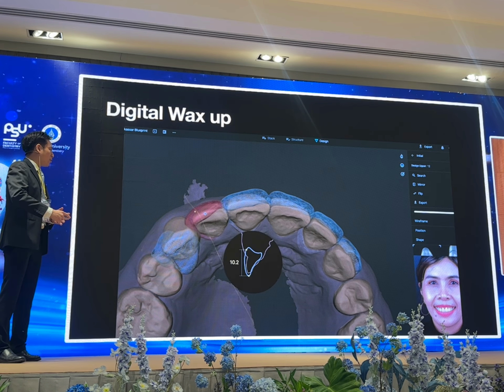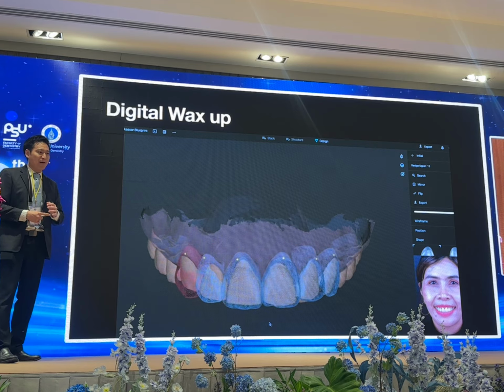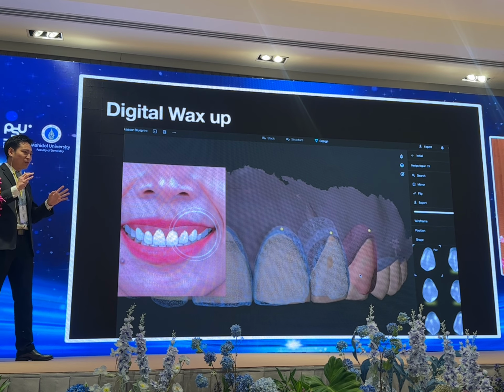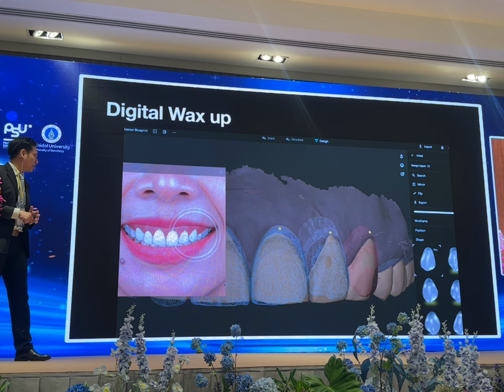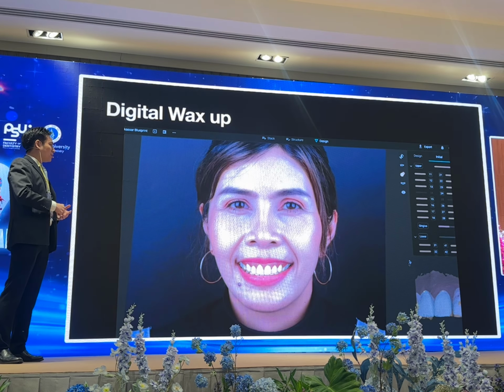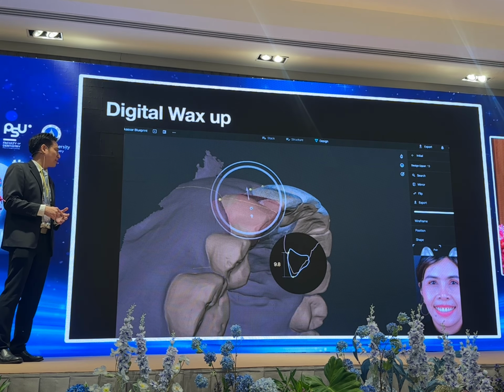After we notice all the information, we can do 2 setups. We arrange the teeth in the model. If you don't like it, let's say it's a little bit too distalized, too mesialized, a little bit too big, too small, you can adjust it like this. Basically, you just do a tooth setup in the software and you see the final result in the patient's mouth.